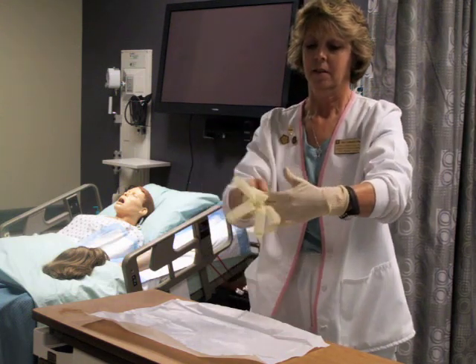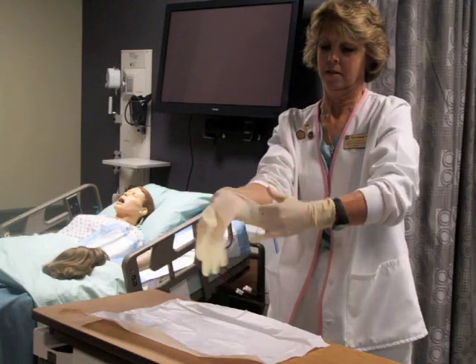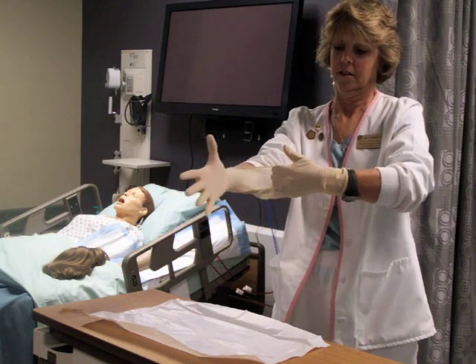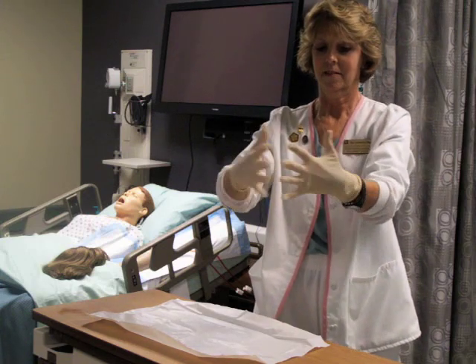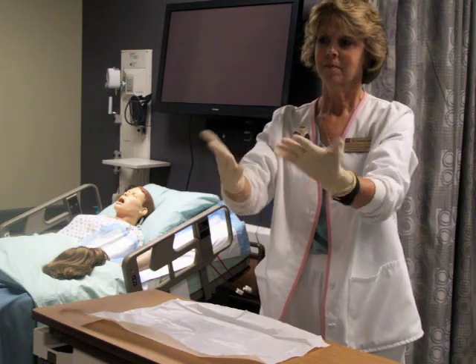Be careful to hold your glove down and let gravity keep the fingers of the glove away from the non-sterile areas. Now you can adjust your gloves as needed so that all fingers are in position.